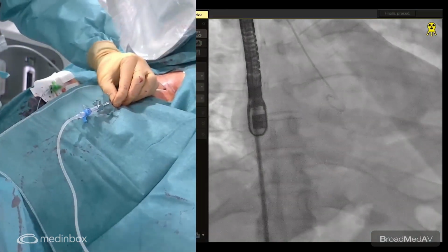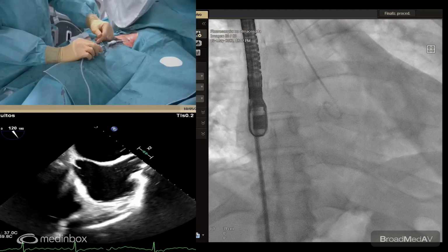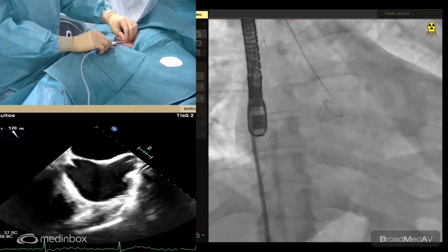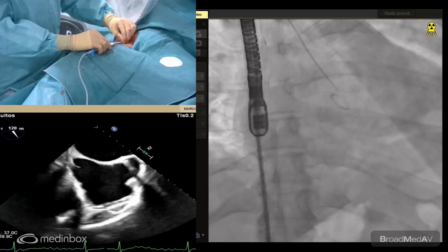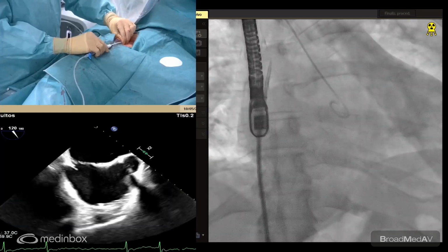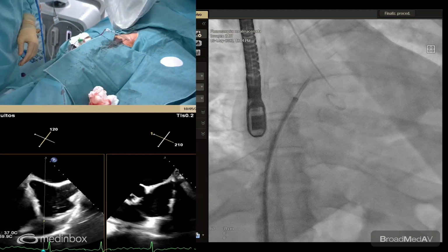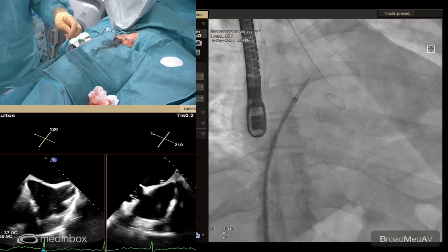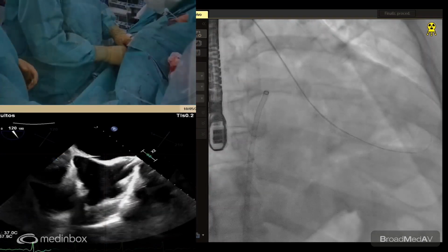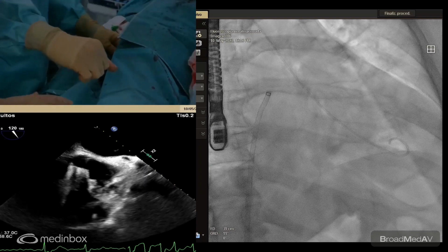So okay, we're going to start the transeptal puncture. As you can see, we have the echo guidance. We have the needle pointing in an imaginary clock to 4 or 5 hours, and I'm going to retrieve all the system until Silvia confirms I am in the exact point of the puncture. We're going to try to puncture posteriorly and, yeah, the key to a safe transseptal puncture is it's very easy with the biplane mode. And well, my mean gradient is 8, although it's atrial fibrillation. Okay. We should do an average of several.